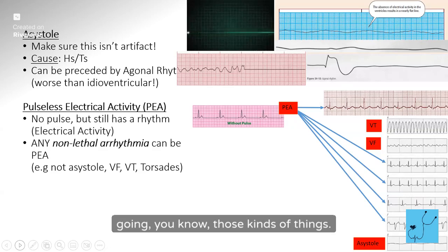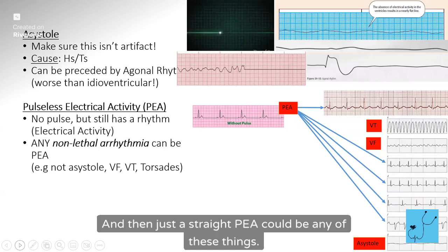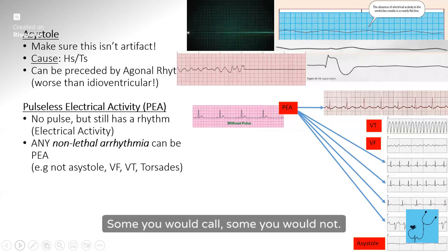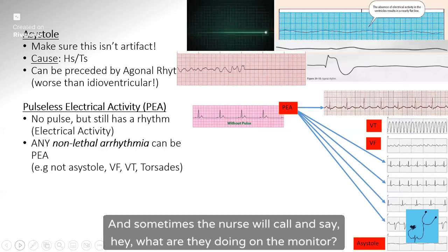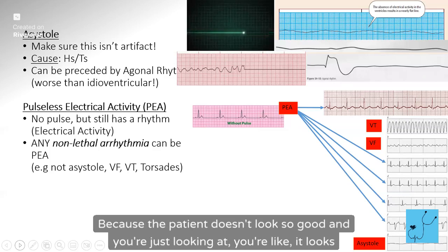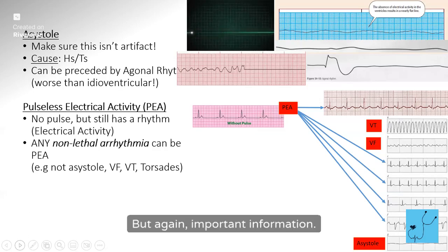So here we have an asystole and then a VFib to asystole. And then just a straight PEA could be any of these things. Some you would call, some you would not. And sometimes the nurse will call and say, hey, what are they doing on the monitor? Because the patient doesn't look so good, and you're looking at it and it looks fine. But again, important information.